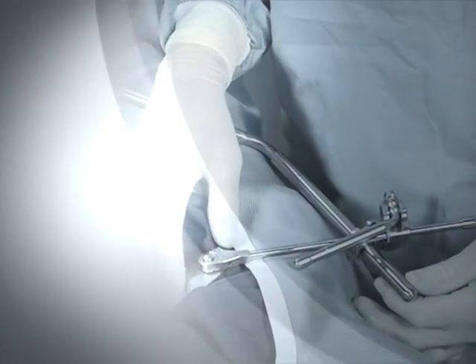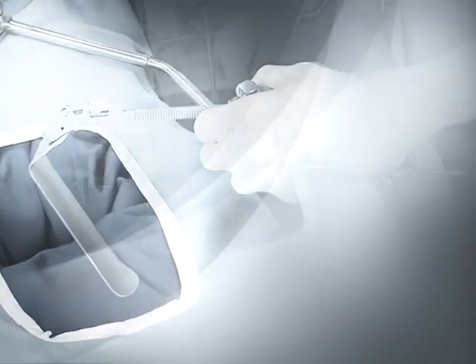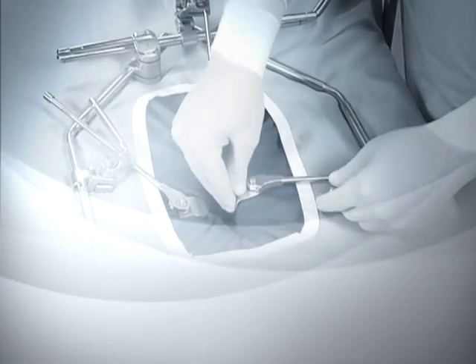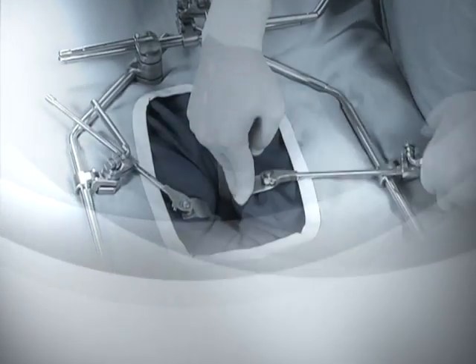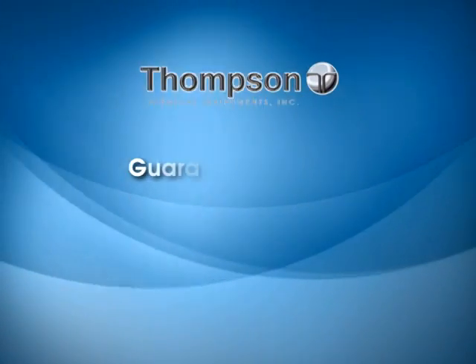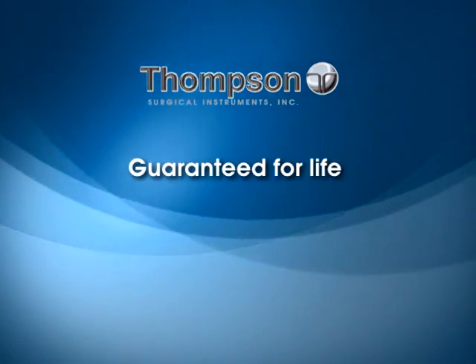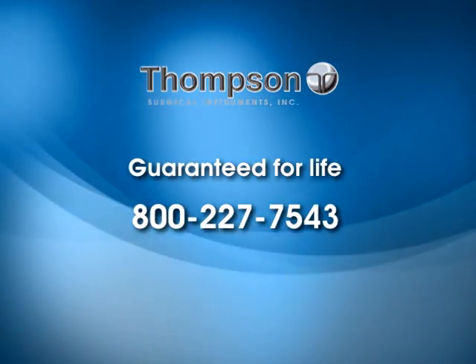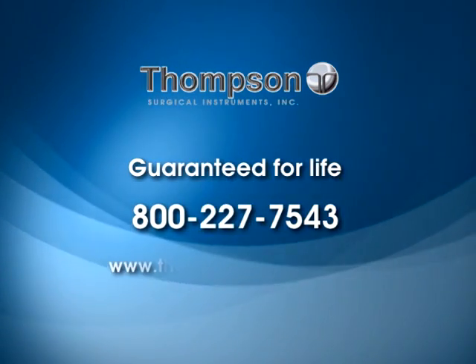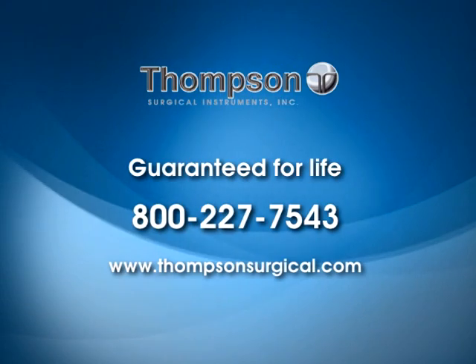No other retractor system can match the power and versatility of the Thompson retractor system. From minimum access surgery to maximum access surgery, its unique one-frame-for-all-procedures capability saves the hospital thousands of dollars in retractor costs. All Thompson frame components are guaranteed for life against defects in materials or workmanship. For assistance, call 800-227-7543 or visit our website at www.thompsonsurgical.com.